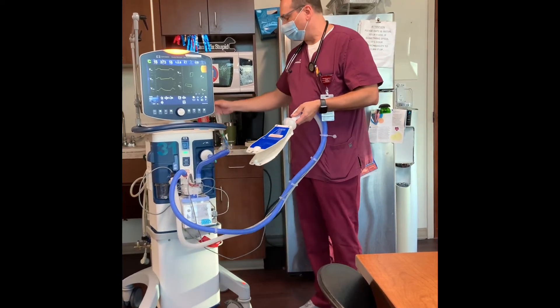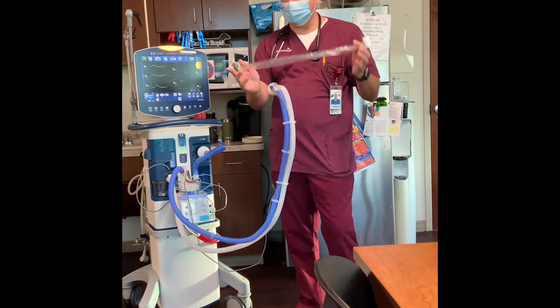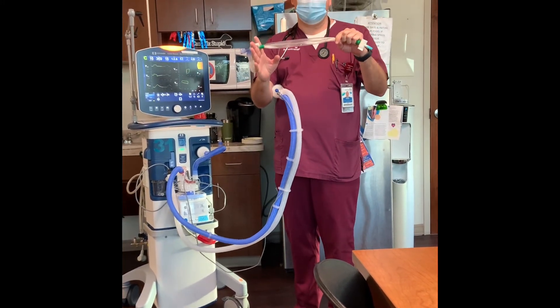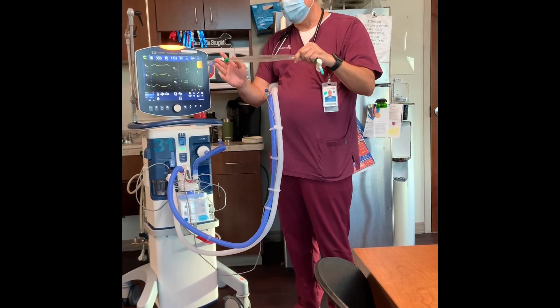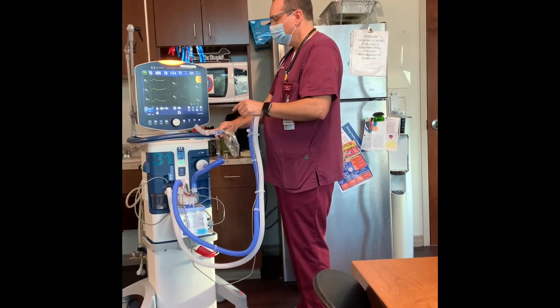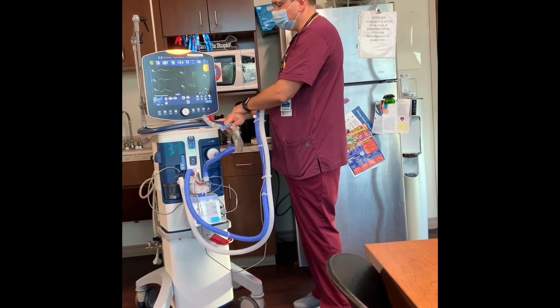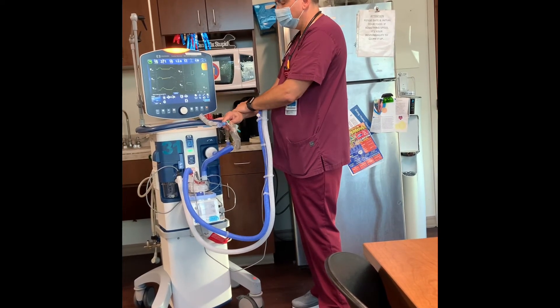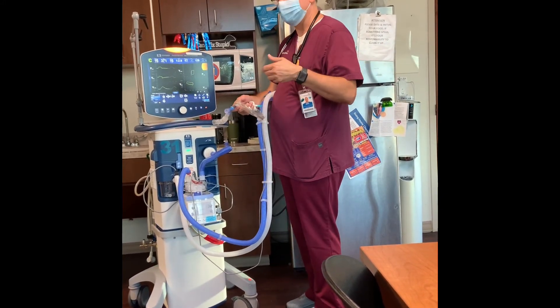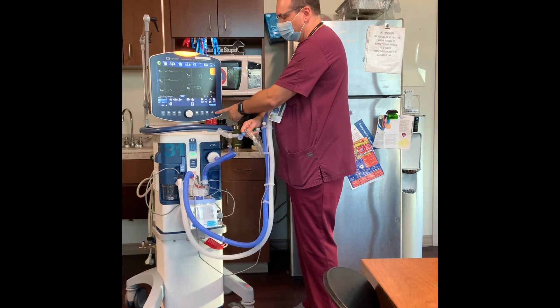Let's talk about suctioning. We use an inline suction catheter — this one is for an endotracheal tube, but suction catheters on trachs are shorter; the function is the same. There are two buttons to be aware of before suctioning. First, hit the alarm silence button in the lower right-hand corner — that silences the alarm for two minutes so it's not alarming while you're suctioning and your colleagues don't come running.